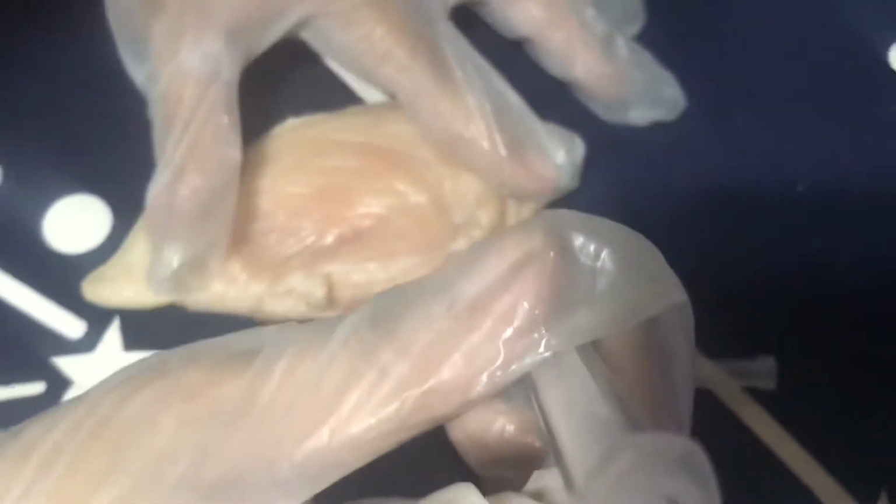Place the ulnar side of the non-dominant hand just below the injection site and pull the patient's skin laterally about 1 to 1.5 inches. Hold the position until you insert the needle.